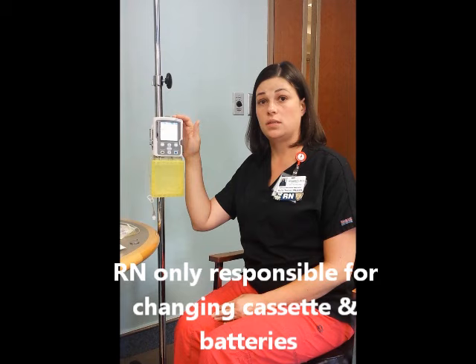Hi, I'm here to teach you about the new CAD Solus pumps, which will be coming to the unit soon. They're going to be used for peripheral nerve blocks and epidurals. The RN will be responsible for learning how to change the cassette and replace the batteries.